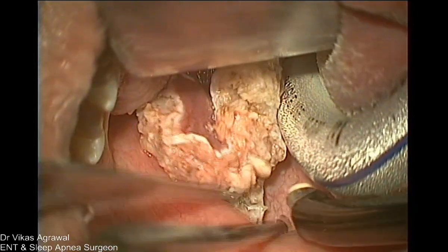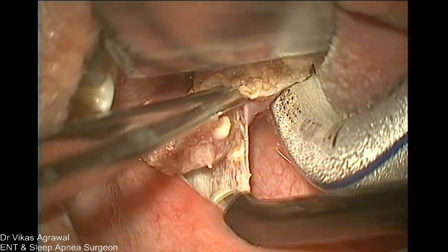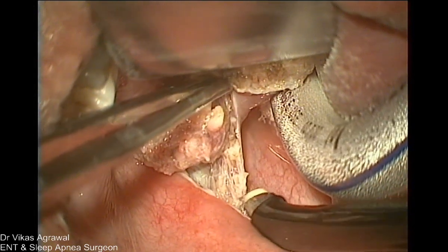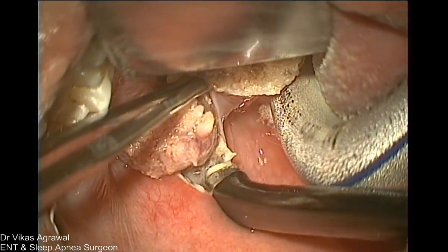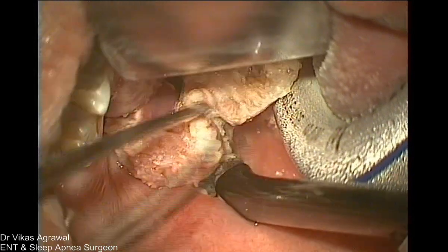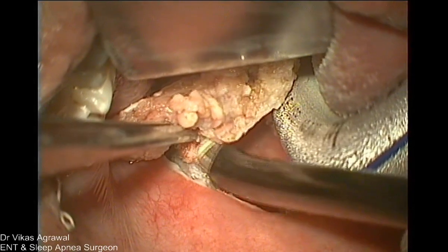This is the tonsil, and when we are removing the posterior pillar, this is the vertical fiber, clear? Right. And this is the oblique fiber. Whatever plane we have created, we'll continue in that plane and remove the oblique fibers.